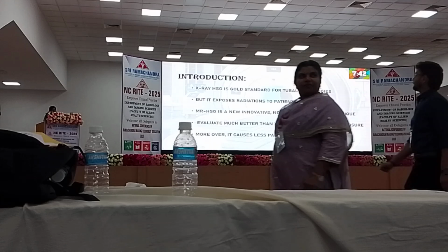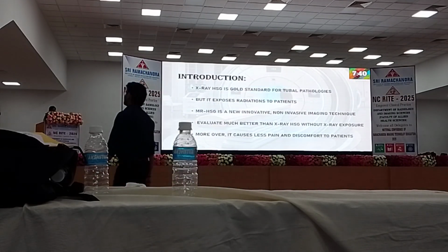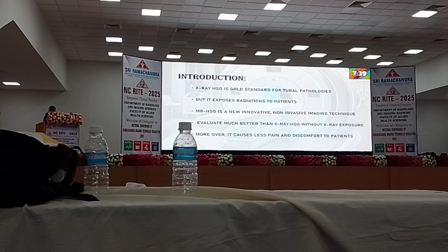Introduction. X-ray HSG is a gold standard for tubal pathology, but it exposes the patient to radiation. MR HSG is a new, innovative, non-invasive imaging technique, which evaluates much better than the X-ray HSG without the X-ray exposure. Moreover, it causes less pain and discomfort to the patient.